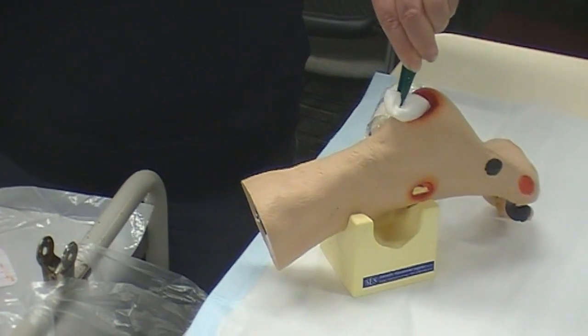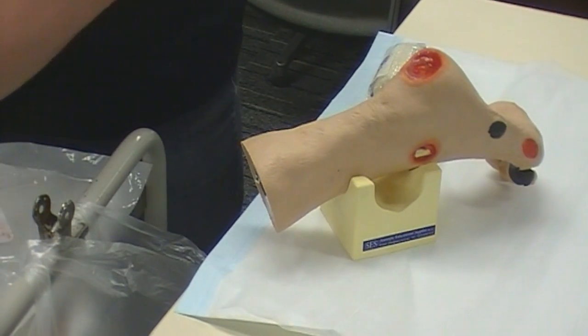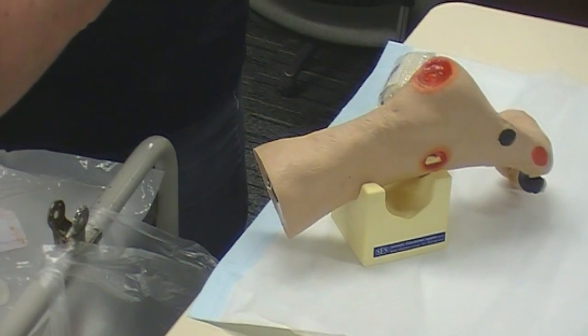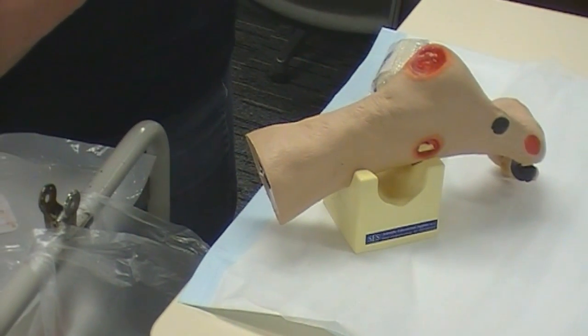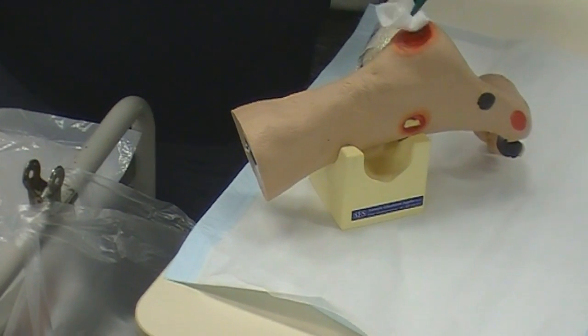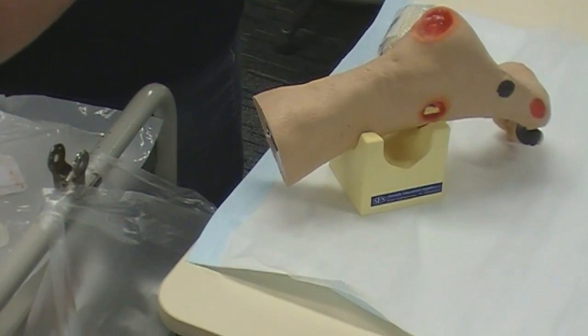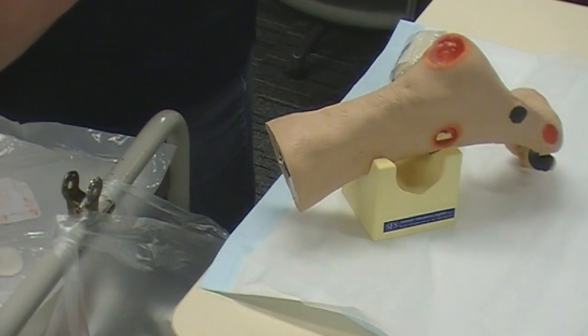Drying from the centre and out — I'll give that two passes — and then I'll dry the edges, because we want our dressing to stay on the wound. If we've got any adhesives, they're not going to adhere to the skin if it's wet or damp.